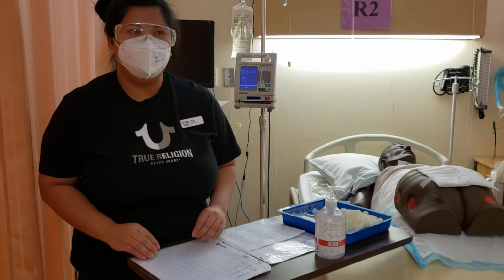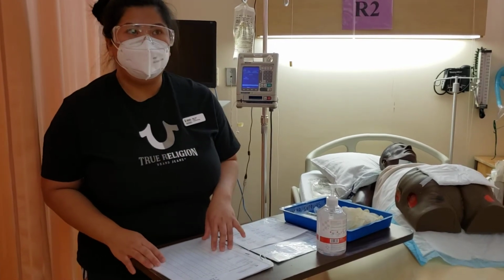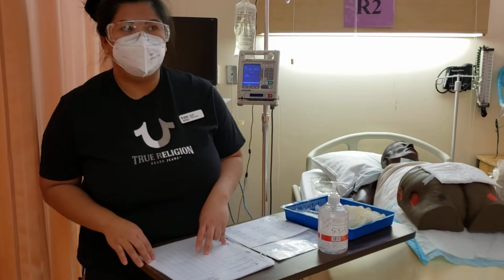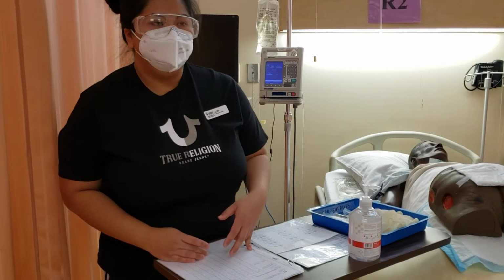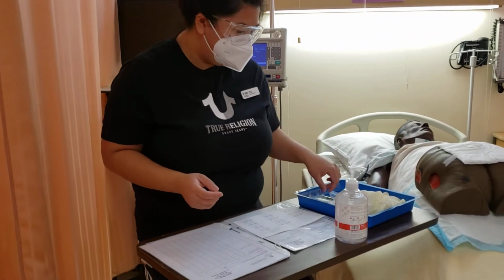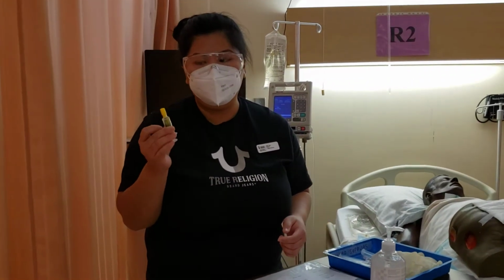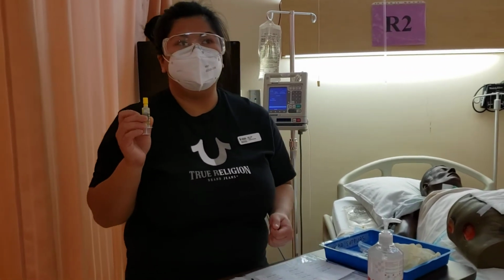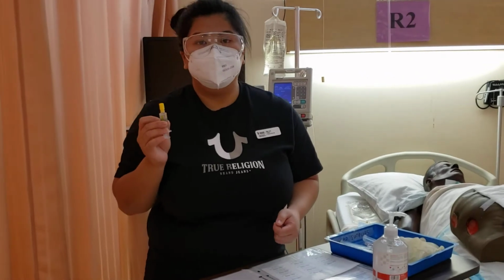Demonstrating how to obtain a blood sample from central venous access. So we reviewed our patient's chart. Our patient has subclavian central venous access. Then I'll do hand hygiene and gather my supplies. I already prepared my heparin prefilled syringe. I've already checked the facility's policy regarding heparin locking, as well as my physician's order for heparin locking.